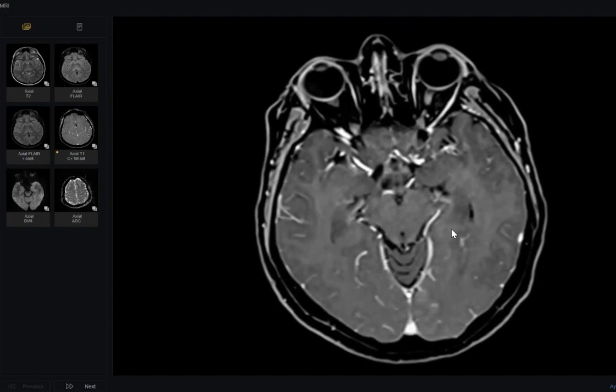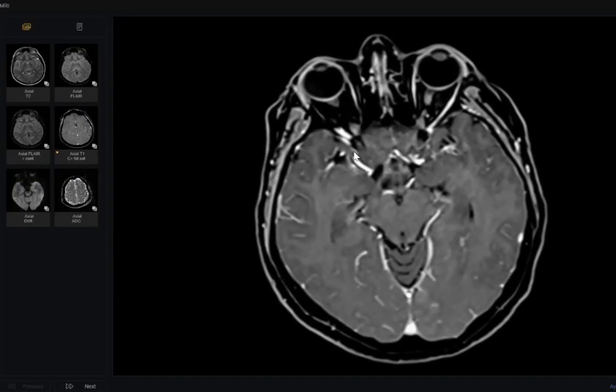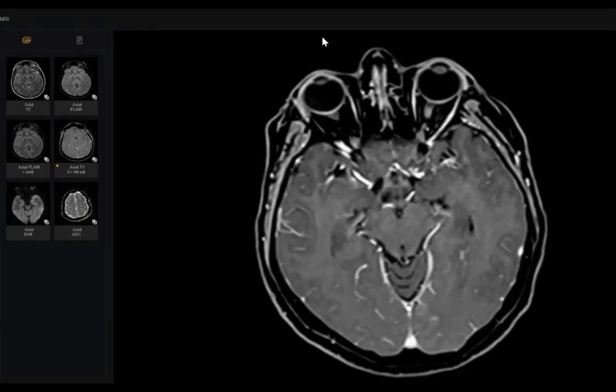Very dedicated. I have never seen this sequence done for any other disease in the brain. Anyone know? Because it is a very rare sequence. All of us know it, but we can't expect this type of sequence is done for meningitis. Anyone know? The FLAIR sequence. Dr. Throsy, excellent. Thank you. Someone answer it. I will answer later on.